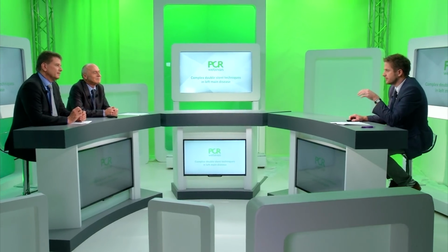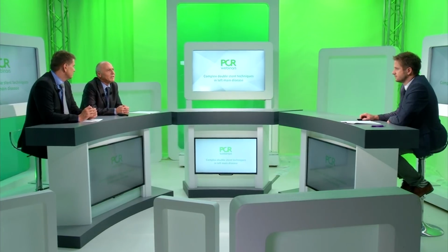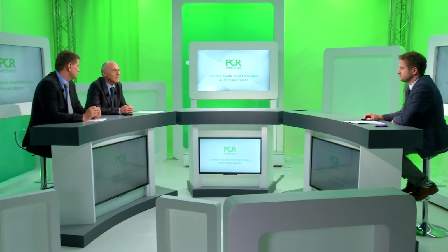We have a question from the audience, an interesting question. You mentioned pre-dilation LAD, pre-dilation circ, and that you did it one after the other. The question is, why not kissing immediately? I never do kissing because I think you just risk dissection of the left main with 2 balloons. And then, of course, this can make your life more difficult. What about you? I do not see so much sense in that.